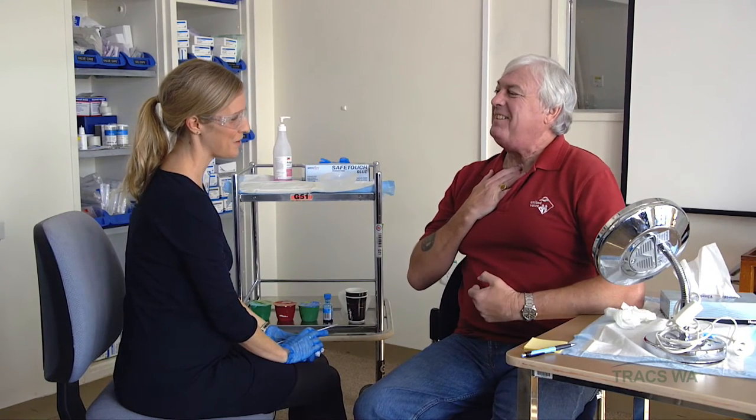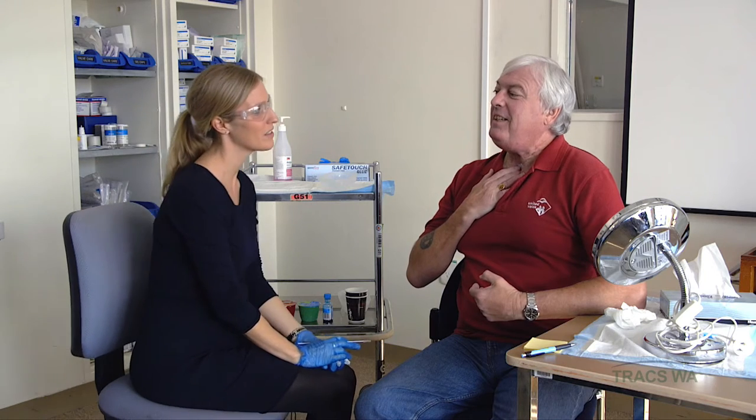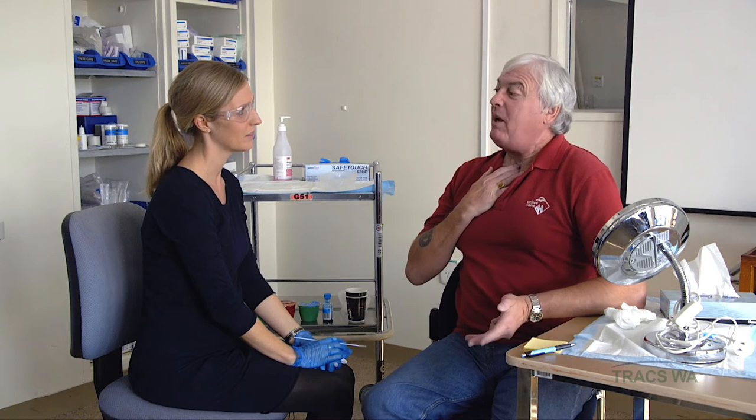I can speak. It's a lot better, isn't it? That sounds a lot better to me. Is that your normal voice? Yes. Yeah? Does it feel like it usually should? Is it as easy as it normally comes out? Yeah, that's back to normal.